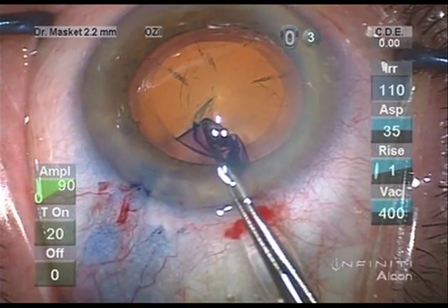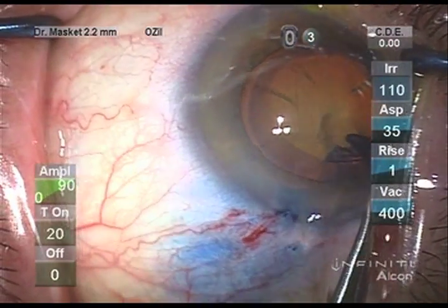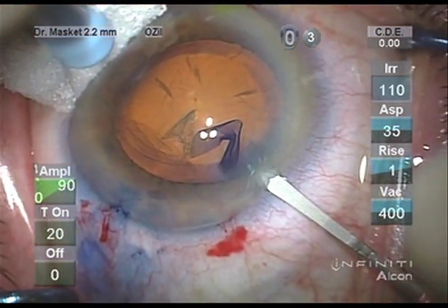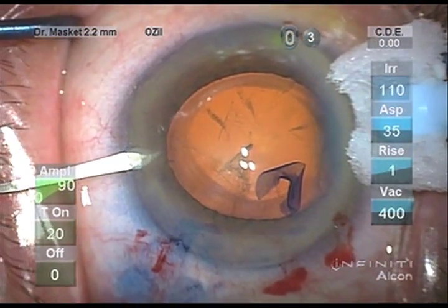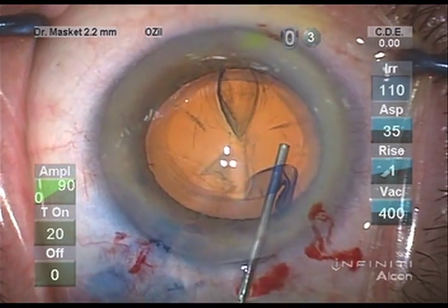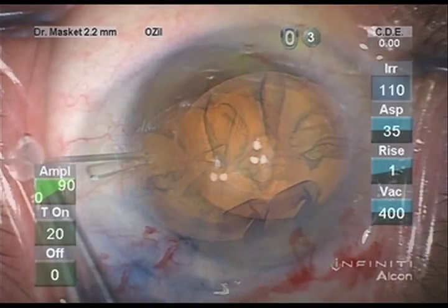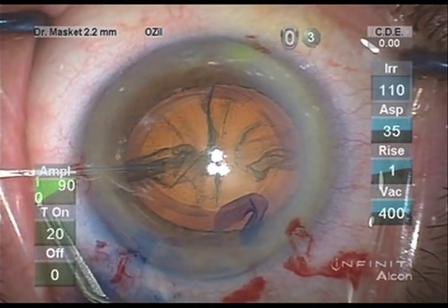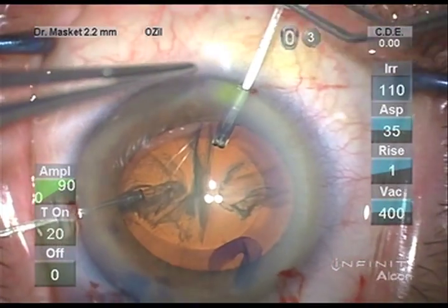Once capsulotomy has been completed, I decided to use capsule support hooks. There are a number of products available for this purpose, but my current preference is the MST hooks that have a continuous loop. In that fashion, they are very kind to the capsule anatomy and are unlikely to tear the capsule edge.